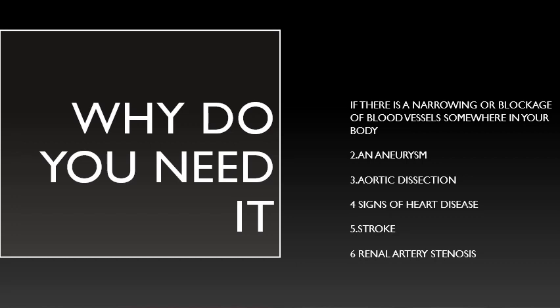If there are any signs of heart disease, to find the cause of stroke, or renal artery stenosis. It is a narrowing of blood vessels in the kidneys that can lead to high blood pressure or even renal failure.